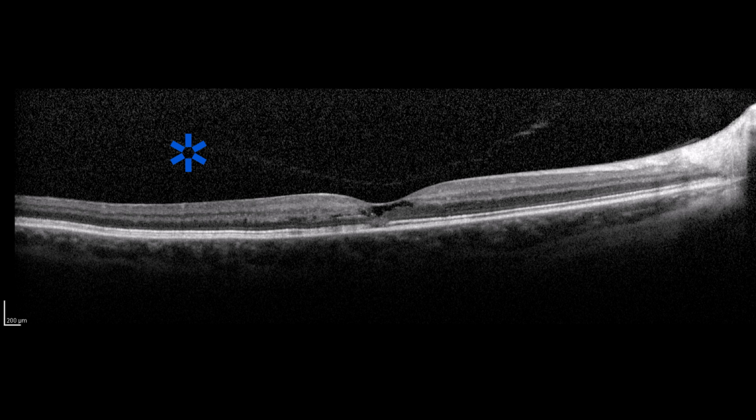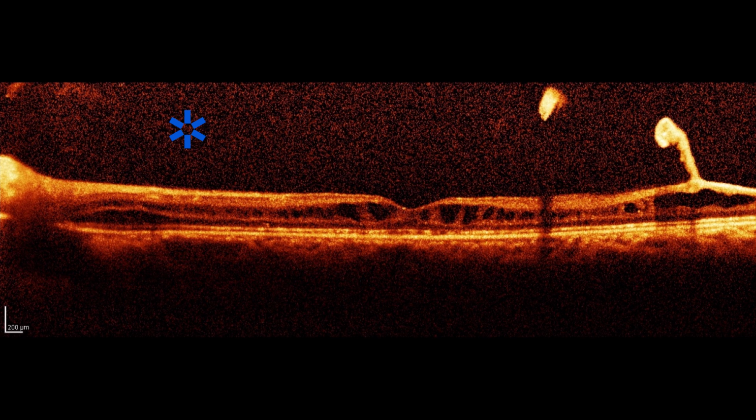This is another patient, same thing, but you also see ellipsoid zone irregularities. So again, my personal theory is that this is somehow a vitreoretinal interface mediated abnormality, some sort of broad-based vitreomacular traction type thing. I have not figured out a way to experimentally prove that or disprove it.